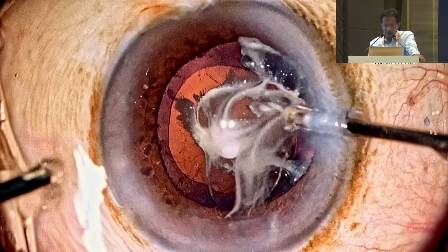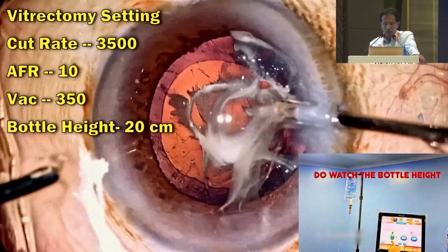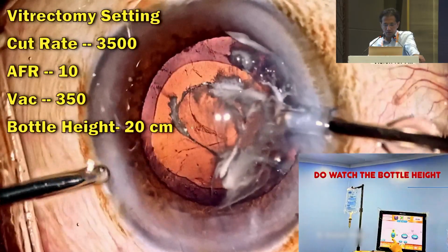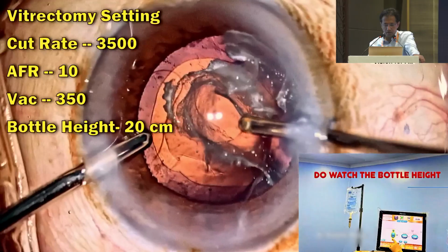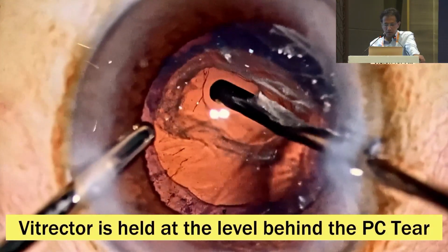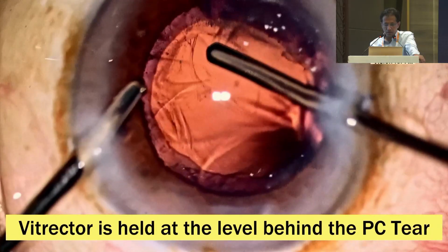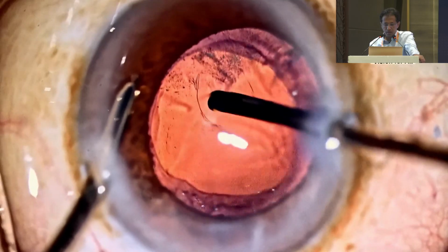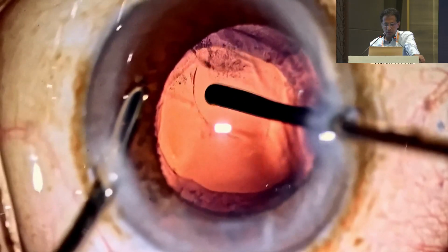The irrigation still has not gone in. The first thing to do is to decrease the infusion pressure before beginning vitrectomy. The infusion is started with a bottle height of just 20 centimeters. The vitrector is placed just below the posterior capsular tear, with the port facing sideways first and then posteriorly. The cutting is begun, which takes care of the vitreous around and behind the PC tear.